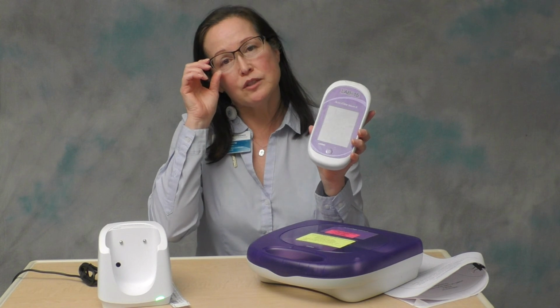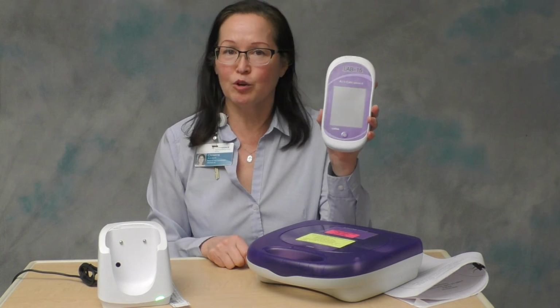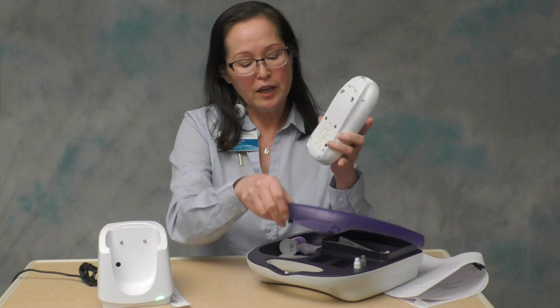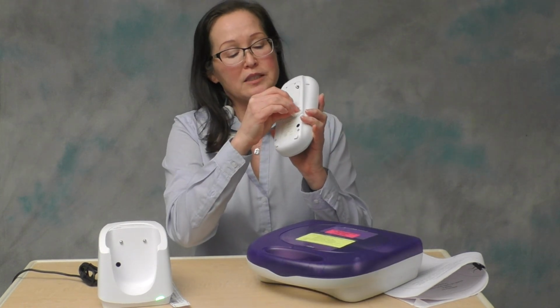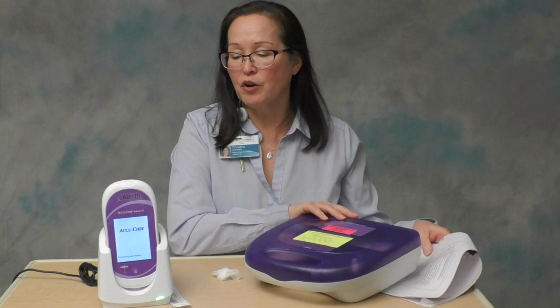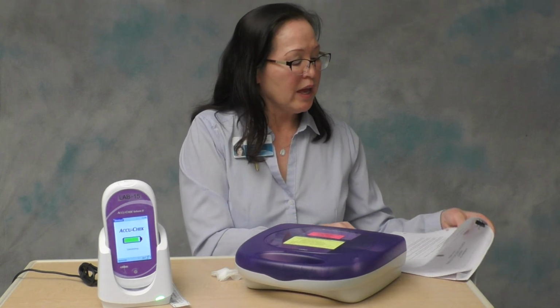The bleach solution has a 4-minute contact time to kill C. diff spores. We do not expect you to stand there and hold it for 4 minutes while C. diff spores are getting killed. So you can redock it. Before you redock it, make sure that you dry off those metal battery contacts so that they're nice and dry when they go back into the dock, and that prevents a rust film from developing. Right, that's disinfecting the meter.